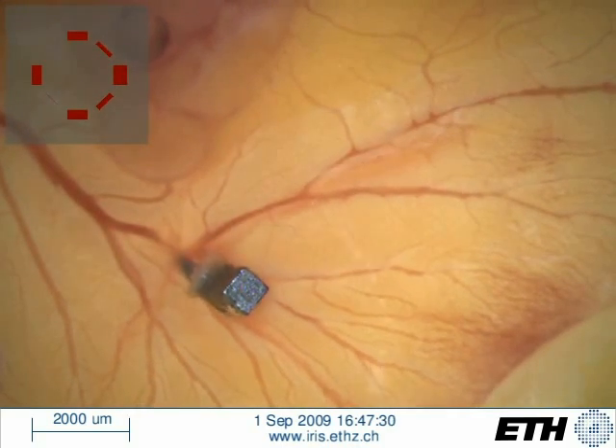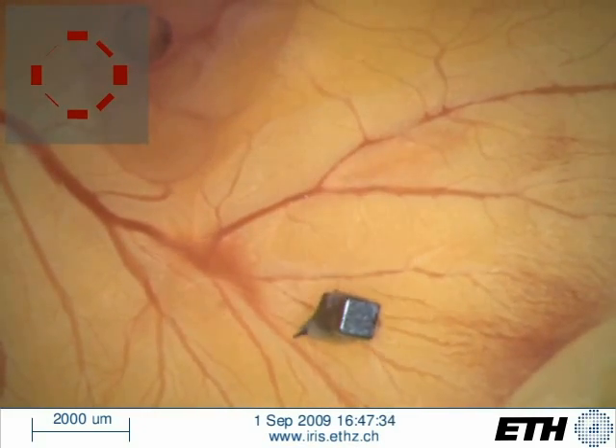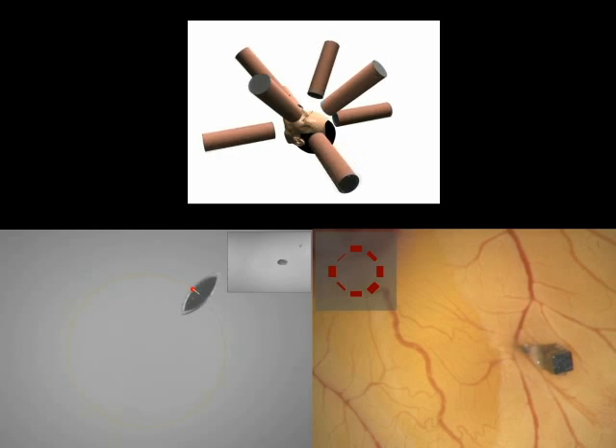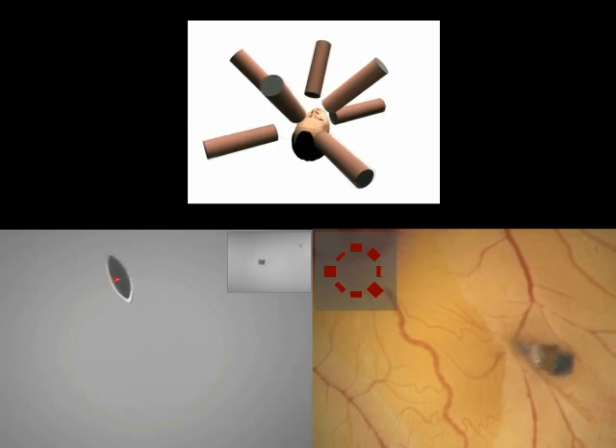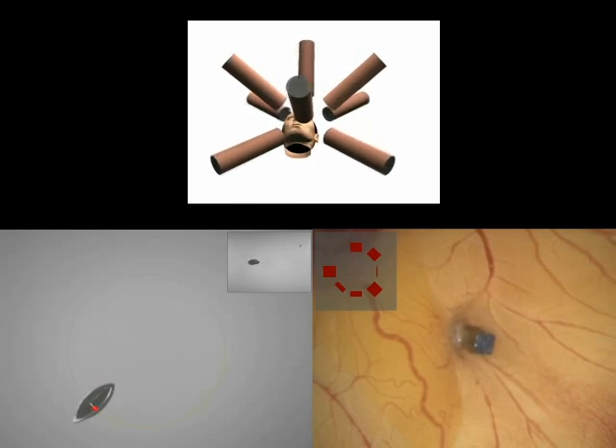We have presented 5 degree of freedom wireless magnetic control of a fully untethered micro-robot using a novel electromagnetic system that we call Octomag. The system is capable of precise positioning in both closed and open-loop operation modes and shows great promise for future medical applications.